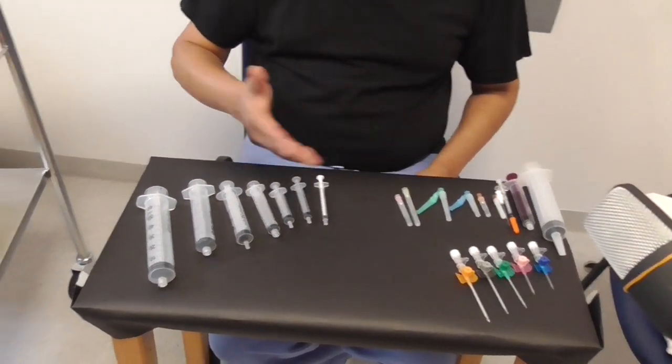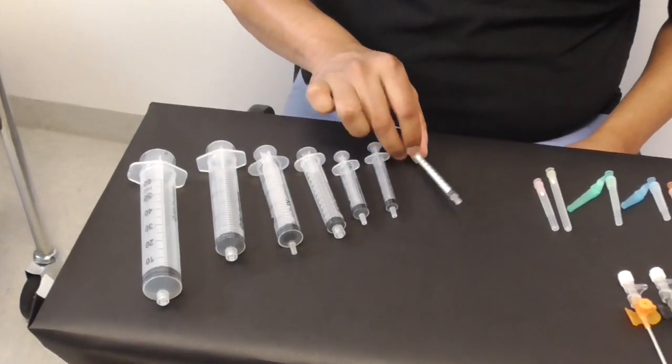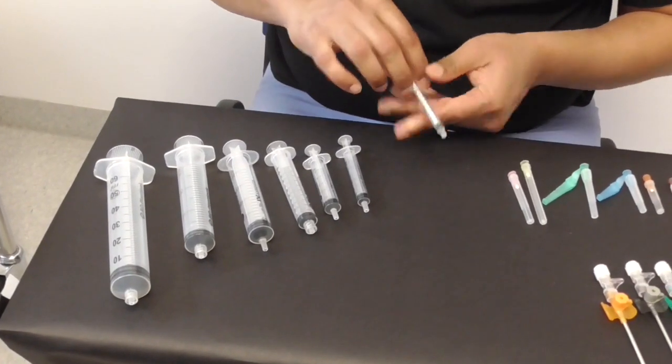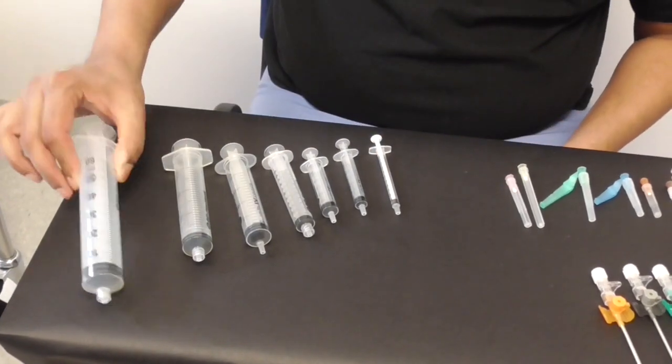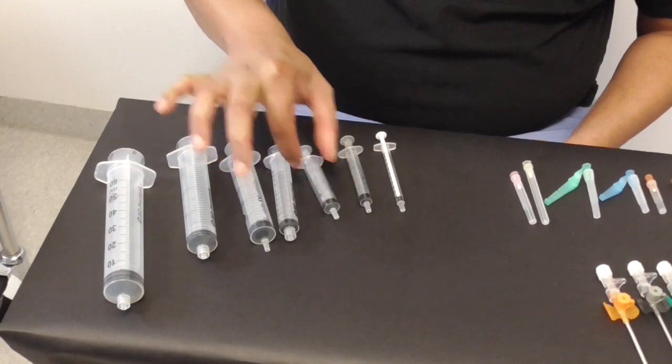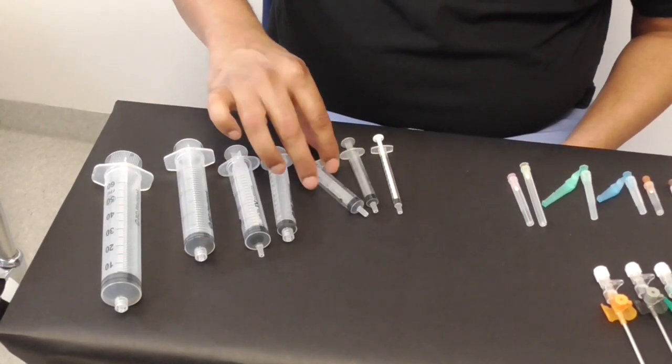So syringes come in a very wide range of sizes. As you can see this one's a one mil syringe so this entire thing just only holds one mil all the way up to 60 mils. The most commonly used ones are 10 mils, 5 mils, 20 mils. So you've got a wide range of sizes of syringes.